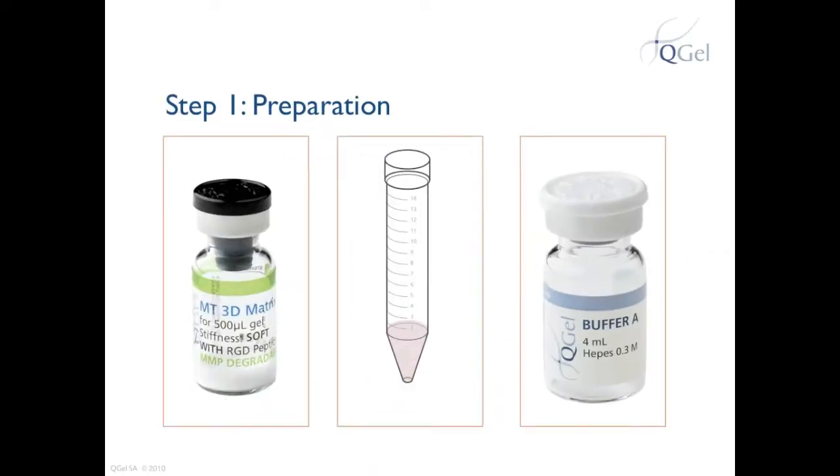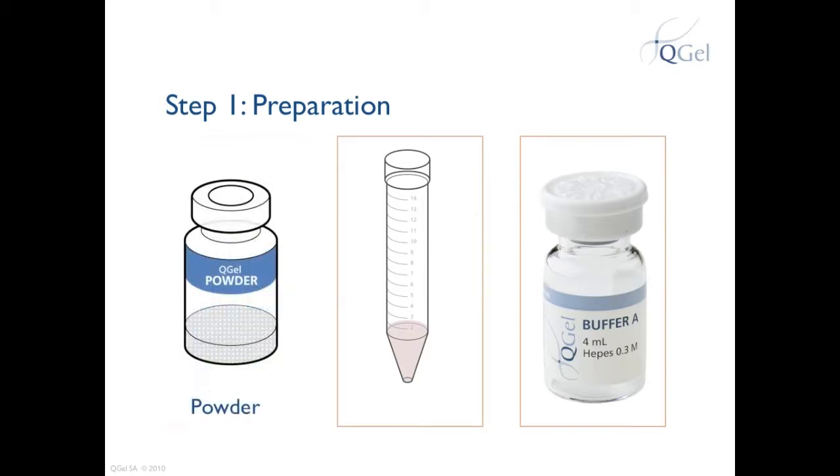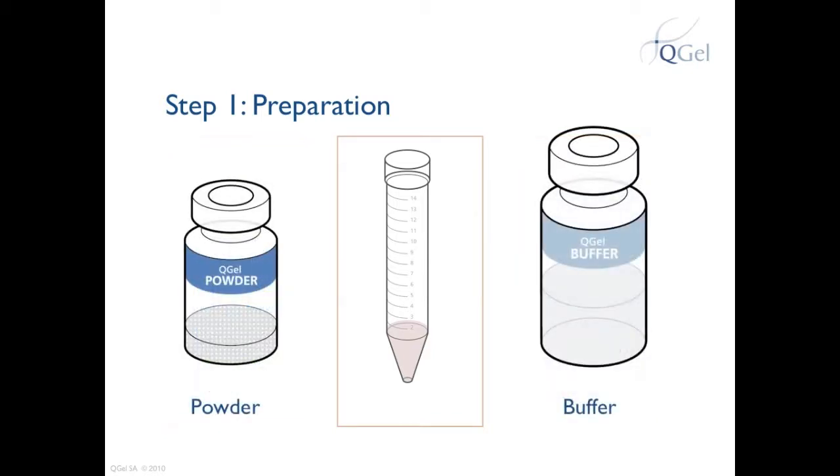The first thing to do is to prepare your vials. Make sure you have QGEL MT3D Matrix, QGEL Buffer, and your cell solution ready. In this video, we call QGEL MT3D Matrix simply powder, and the QGEL Buffer simply buffer.